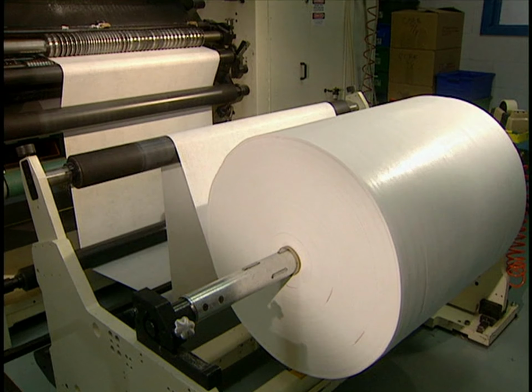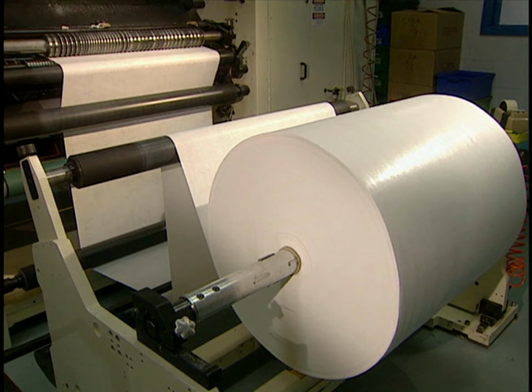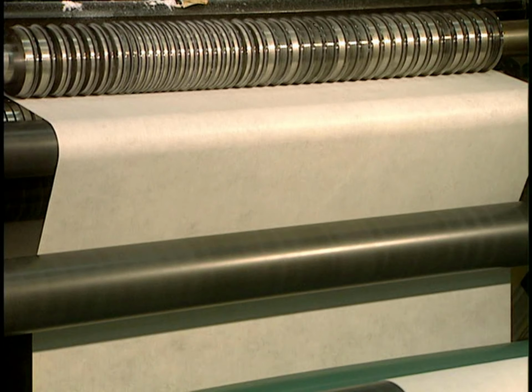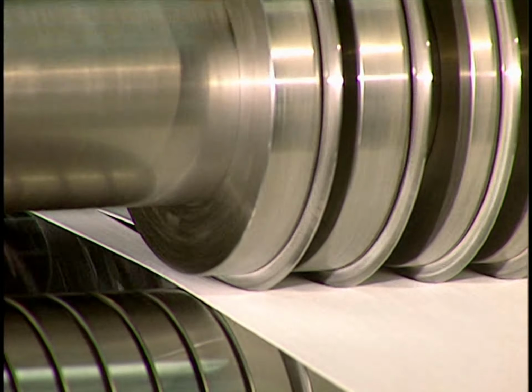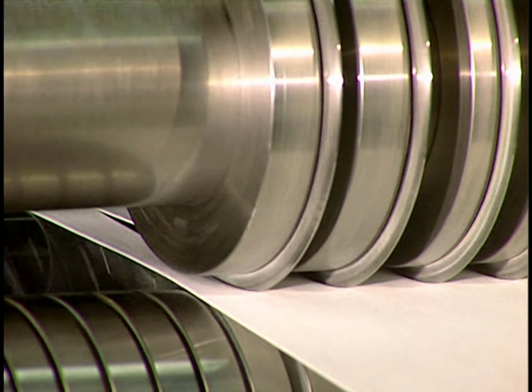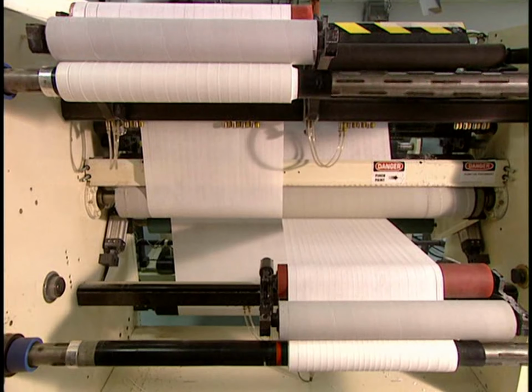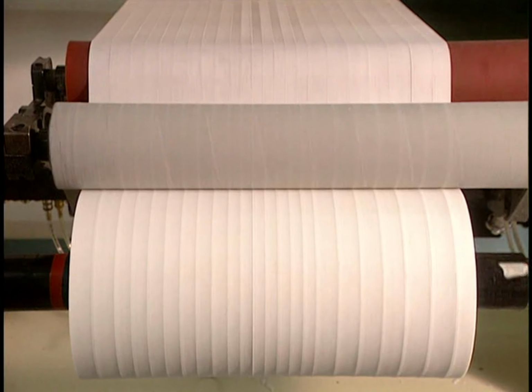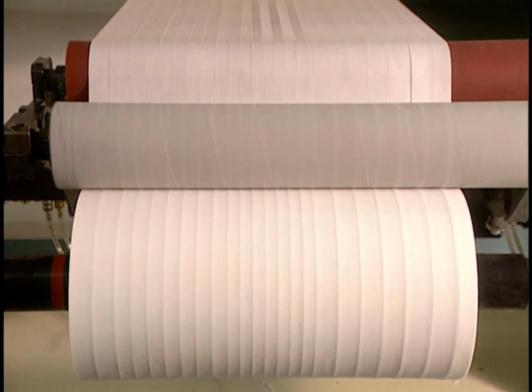The material used for the pads is shown here as a large roll of fabric which will have to be cut. Here a machine cuts the fabric pads. These extremely sharp blades have to be sharpened every 6 months. The cushion fabric is separated into narrow strips, which will later be glued to the ETS fabric.